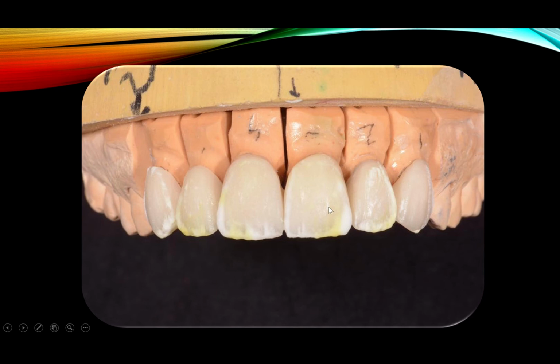After I get it fully pressed, the wax would look very nice, and then they press it, and then they preserve the shape. But I do a little bit of grinding and a little bit of help. Whenever I see that there is a missing line angle, or I want to enhance anything, I just do it with micro layering.